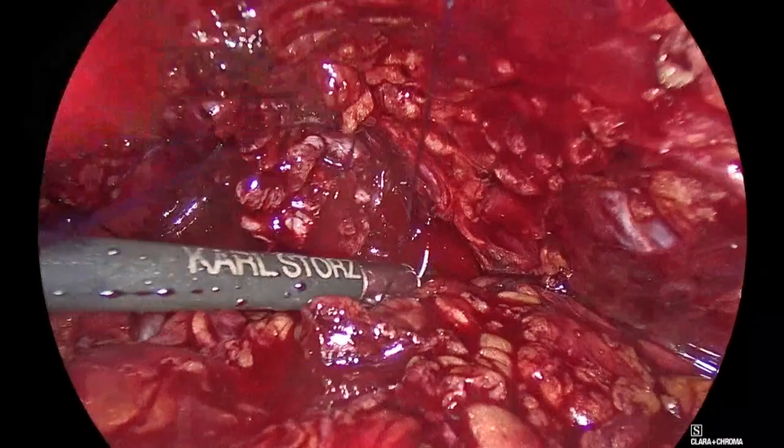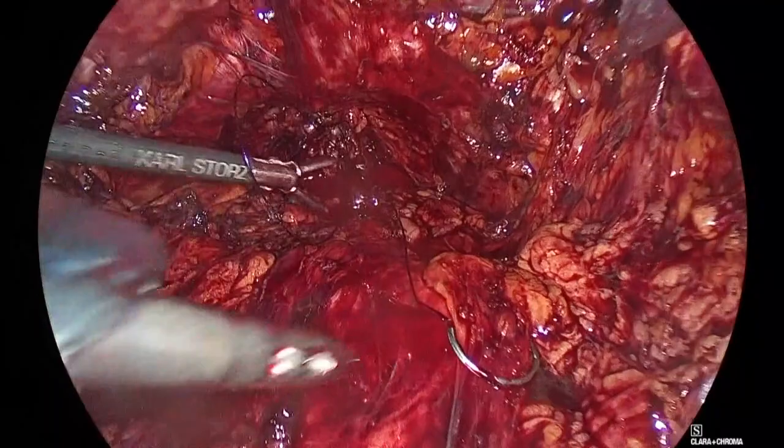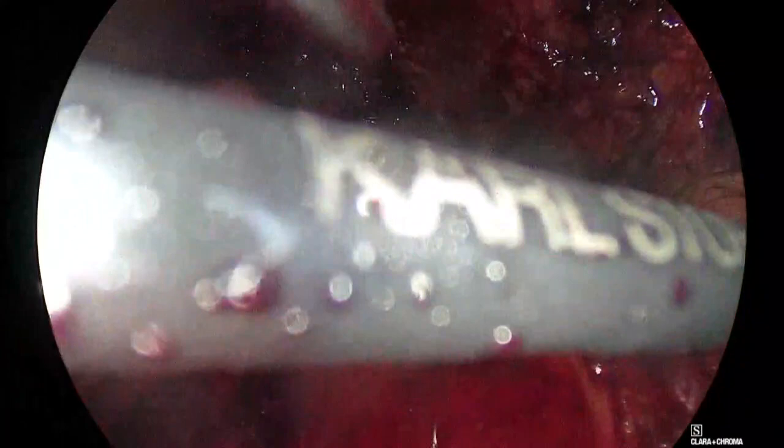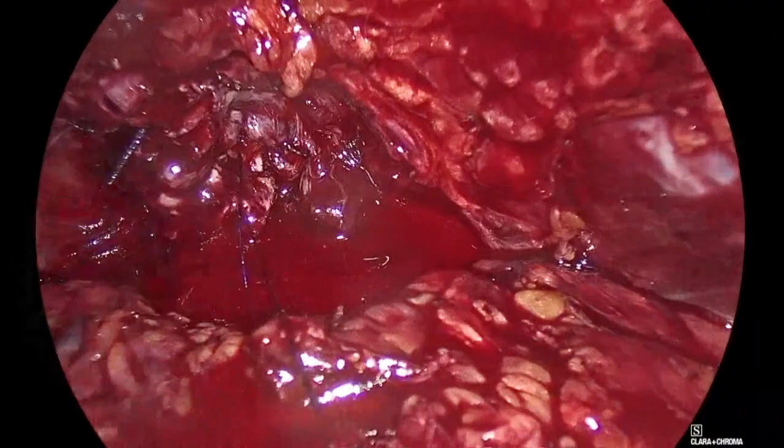Now it's very important here not to cross your sutures. Go back, Padeli. Panayotis, you're fighting with me. Come in. I want to make sure that it isn't crossing. It isn't crossing. Good. Aspirate. Wait. Good. Not yet, Panagiotis, not yet. Good, very good. Go back.